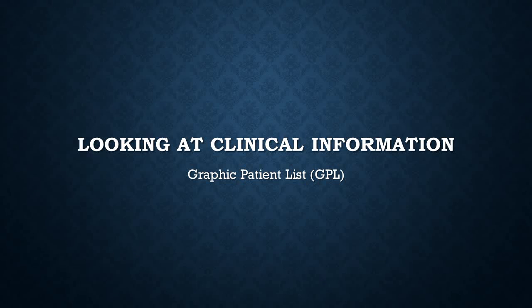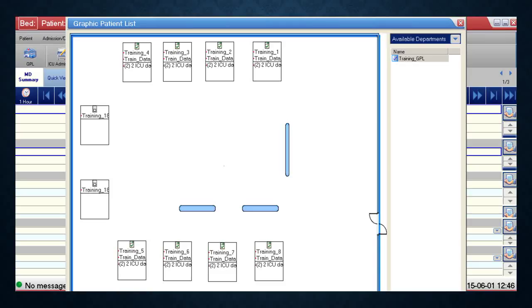Now that you know how to get into the system, it's time to get into the meat and potatoes of actually using it. I'll start by walking you through how to look up patient information using the Graphic Patient List, or GPL. The GPL comes up by default after you've logged in. It provides a graphical way to select a patient, designed in the form of beds laid out in the same physical location as the beds in the ICU you're currently viewing.